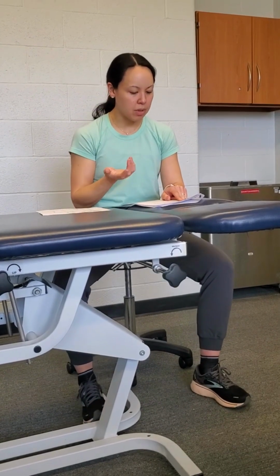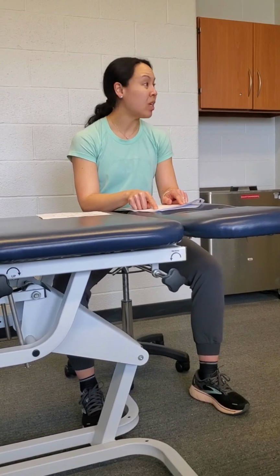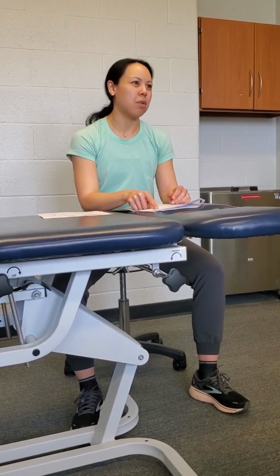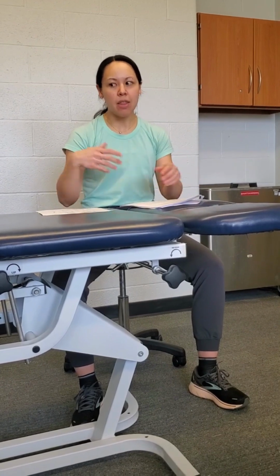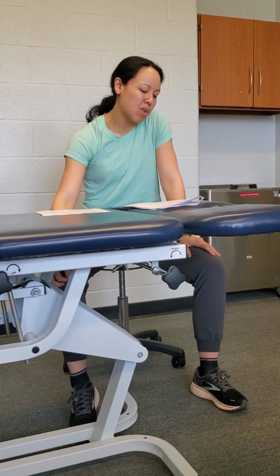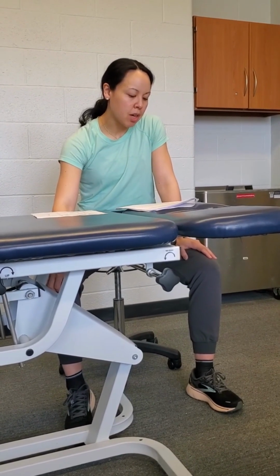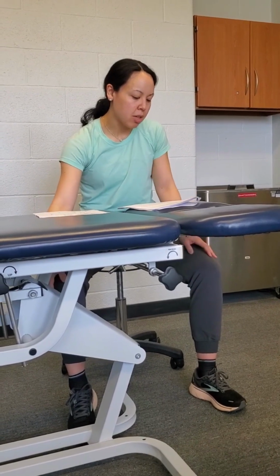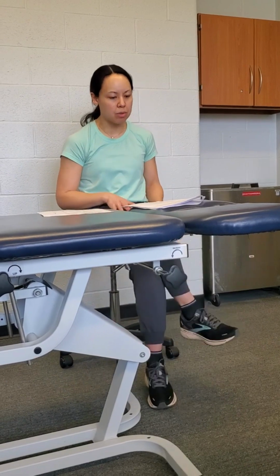So 30 seconds of rest between sets and at least 1 minute of rest or longer between exercises, which is pretty typical. You're going to have to deflate the cuff anyways between exercises, and that's plenty of time. Do not deflate the cuff between sets of the same exercise. I already said that. Do deflate the cuff between different exercises, or if you're working different muscle groups.